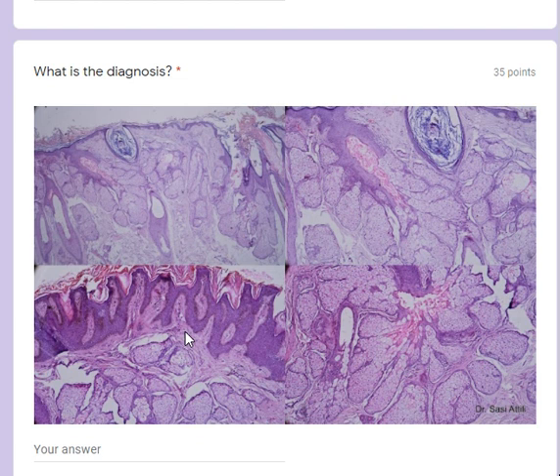So in epidermal nevus, typically there is no sebaceous proliferation. You just see psoriasiform epidermal hyperplasia, acanthosis with hyperkeratosis. You don't see this sort of sebaceous proliferation. You can have other appendageal units, apocrine glands, eccrine glands, also in higher numbers in both entities, to be honest. In a sebaceous nevus of Jadassohn, or nevus sebaceous of Jadassohn as some people call it, you see a predominant organoid proliferation of sebaceous units, and that's the only difference, to be honest. Both are part of the same spectrum.